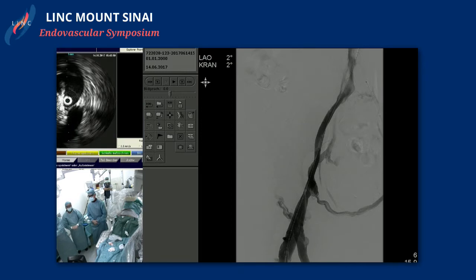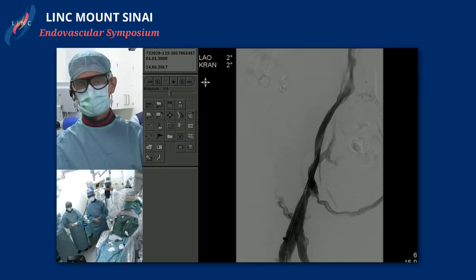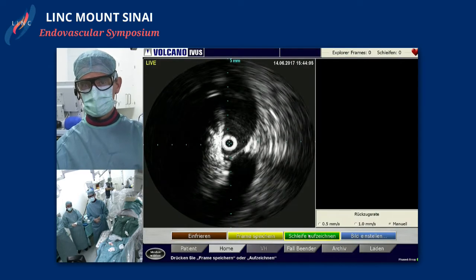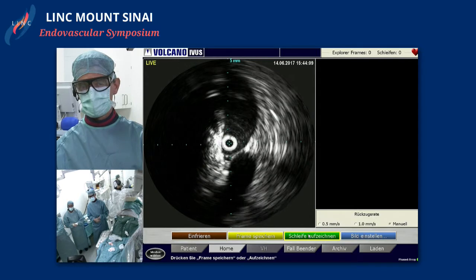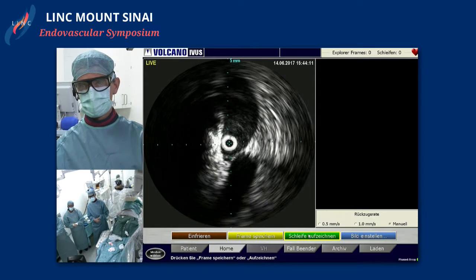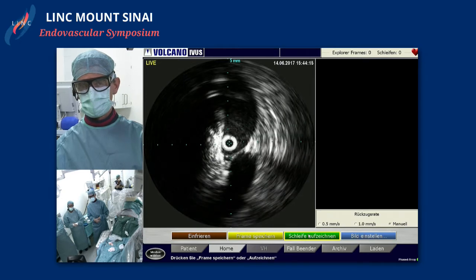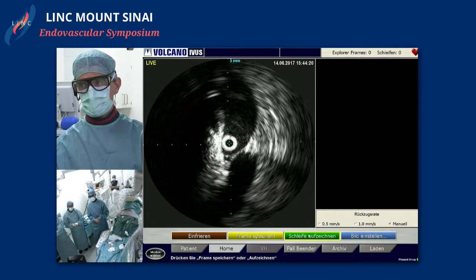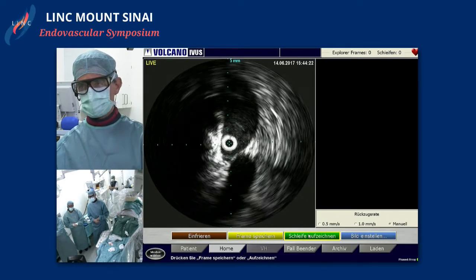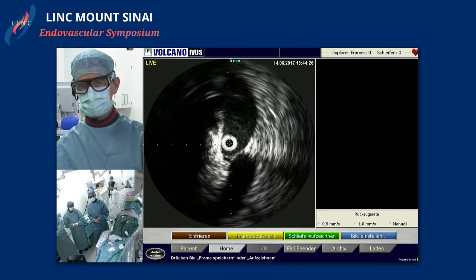Andre, this is a great, great case, and it's a fantastic setup. One of the questions I think we all have in the audience is, when you're doing these chronic DVT cases, especially iliac vein compression syndrome, what kind of intraprocedural anticoagulation do you use? And what do you send the patients home on after they've been reconstructed?